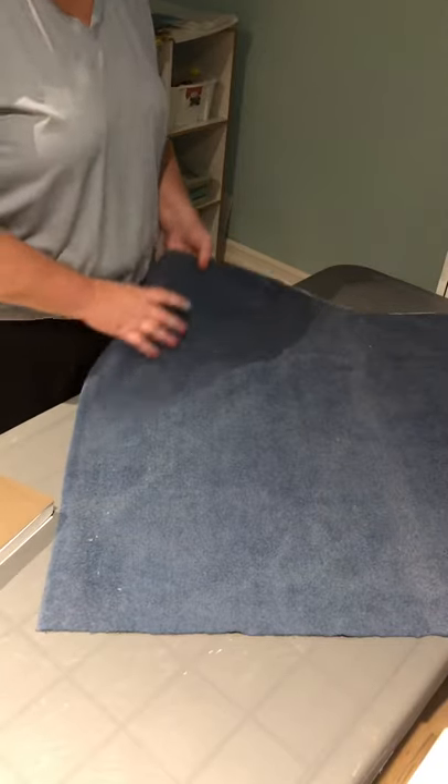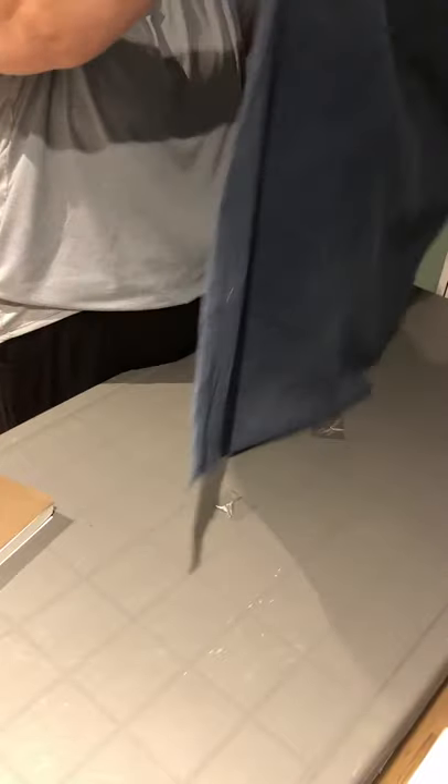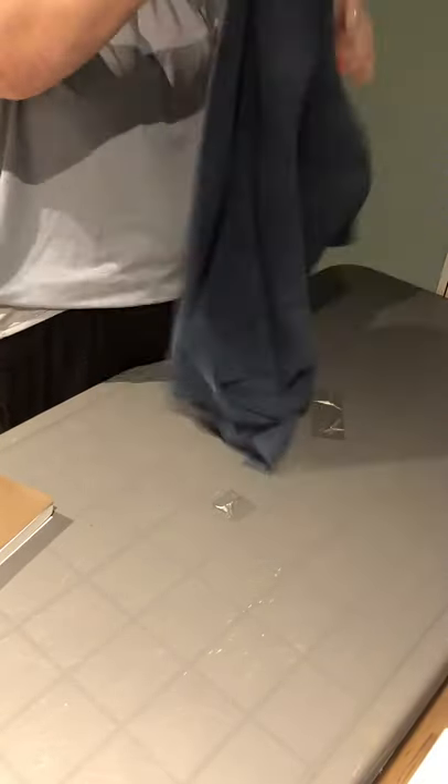First I'm going to inspect the wrapper for any holes, tears, or snags, because if there are any, this will affect the sterility of the contents of the package.